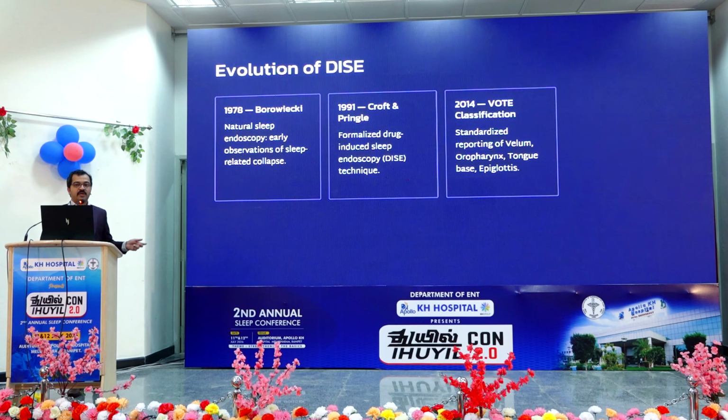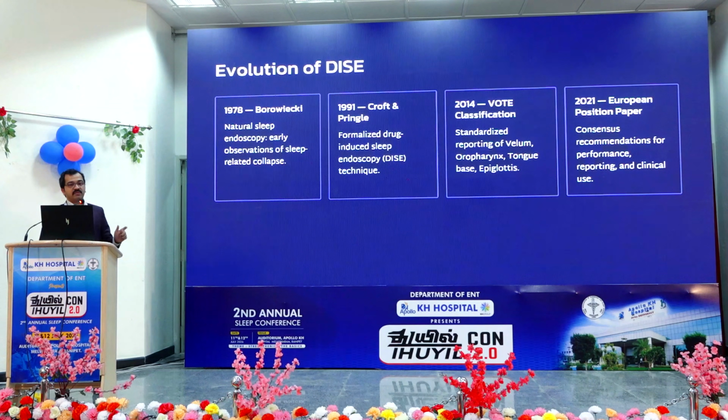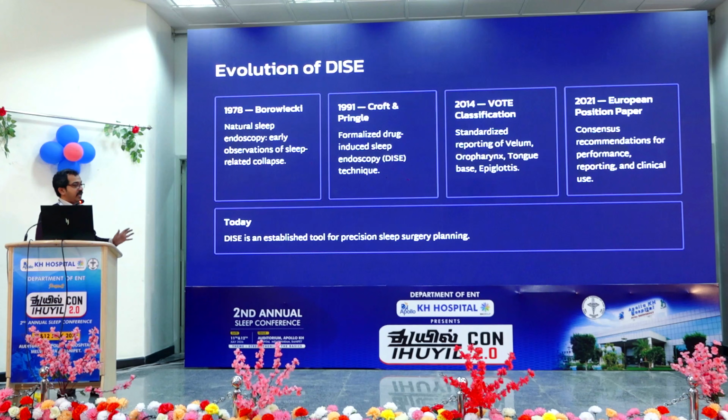In 2014, the VOTE classification was first announced. It standardized the reporting of DISE. And in 2021, the first European paper came for standardizing the procedure, standardizing the scoring system, and taking care of the patients during the DISE procedure. Today, DISE is considered an essential tool in the armamentarium of a sleep surgeon.